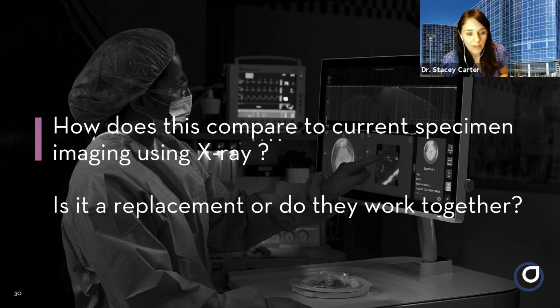In cases where the calcifications are associated with malignancy, OCT can clearly visualize these areas. It can also pick up microcalcifications within the ducts. We saw that again in several examples. I think X-ray is a really useful tool for wire localization and determining that our seed or our SAVI or radar reflector or our Mag Seed is clearly visualized within the specimen, and we can pick up some of those microcalcifications. So it's useful in that regard.